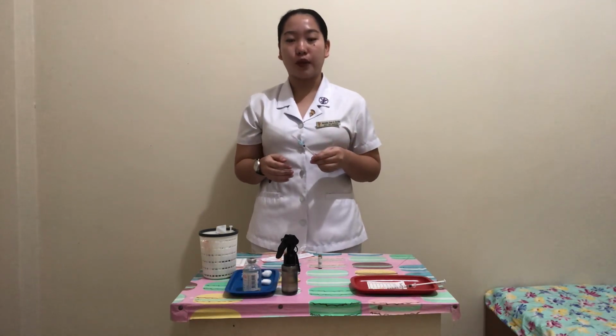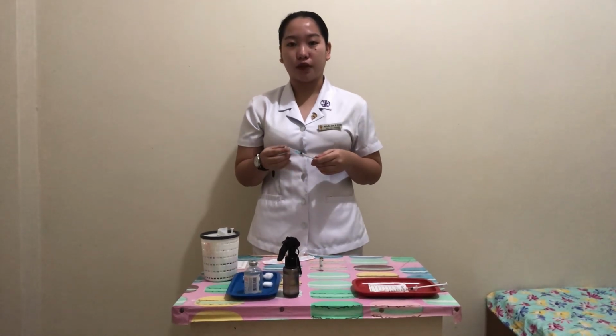So now remove the cap from the filter needle and insert the needle into the center of the ampule. Make sure to not touch the rim of the ampule with the needle tip or shaft. And after that, we're going to withdraw the medication from the ampule.